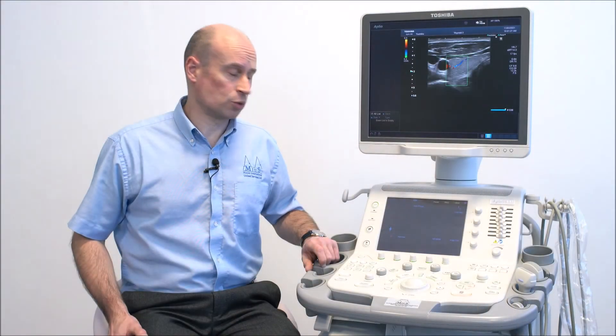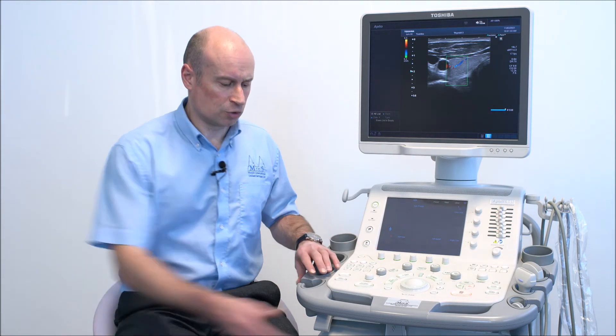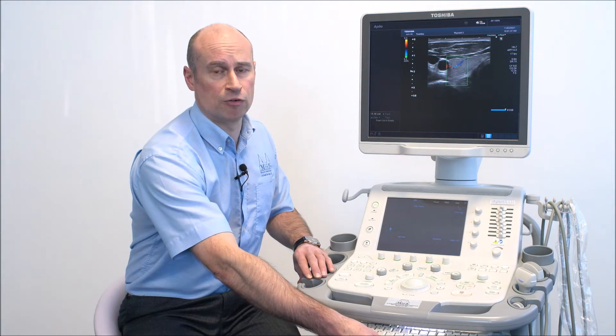The user interface is quite straightforward, utilising a large touchscreen panel and basic controls on the main keyboard. There's also a slide-out keyboard underneath for patient data entry and reporting.